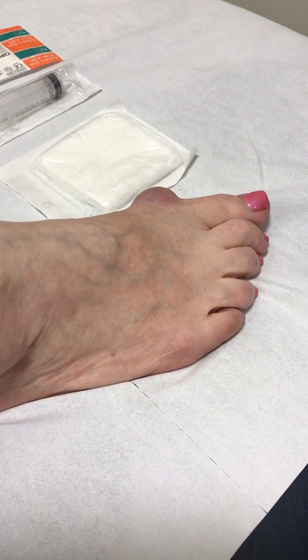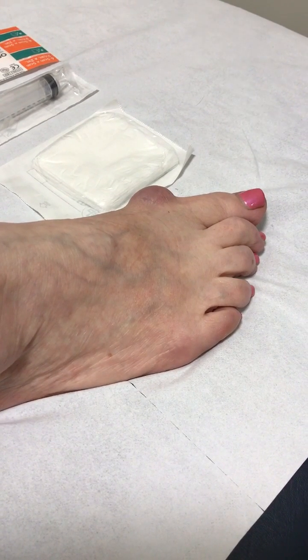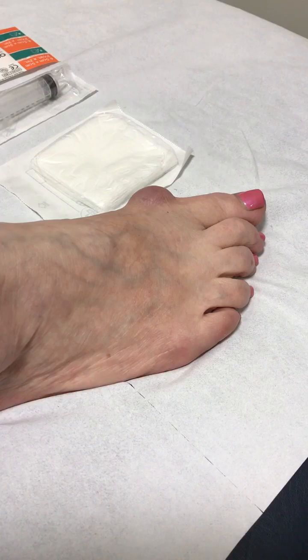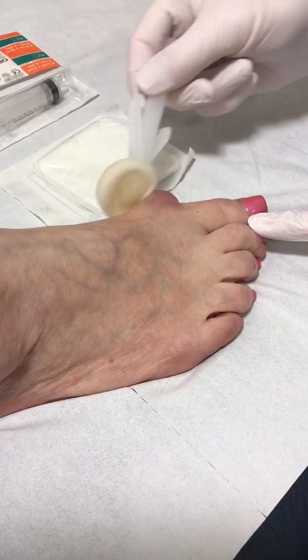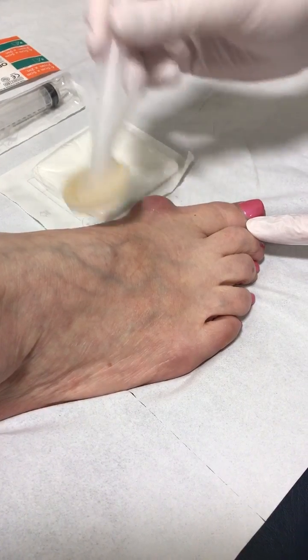Keep it nice and still because my listeners don't like it when there's a lot of angle wobble. So first thing, a bit of skin prep — there's actually quite a lot of fluid there.